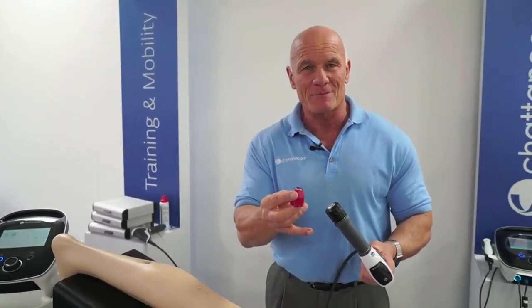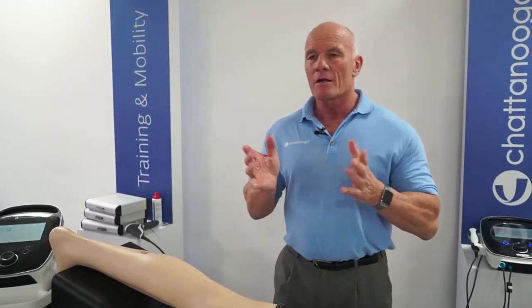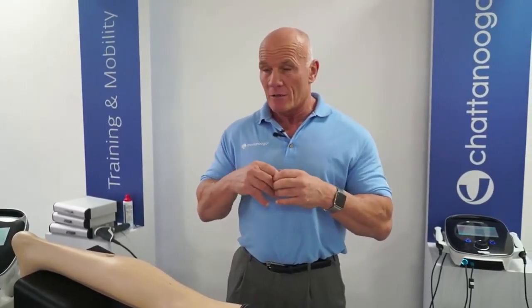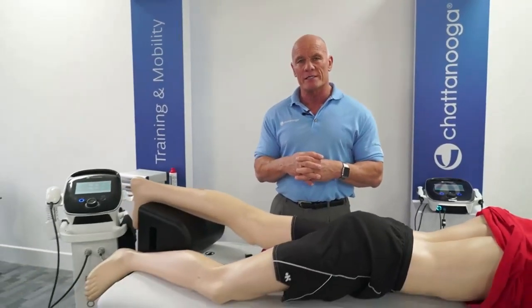So by having a range of transmitters, we can more or less treat anything that comes through our door where radial pressure wave therapy is applicable.